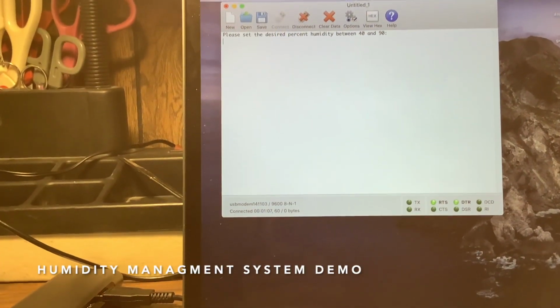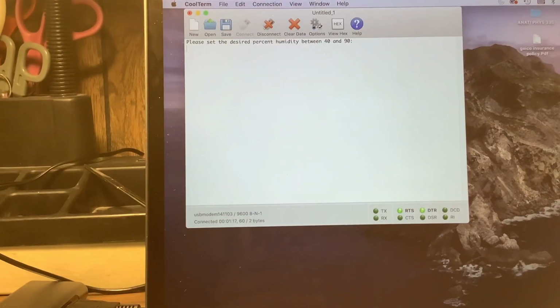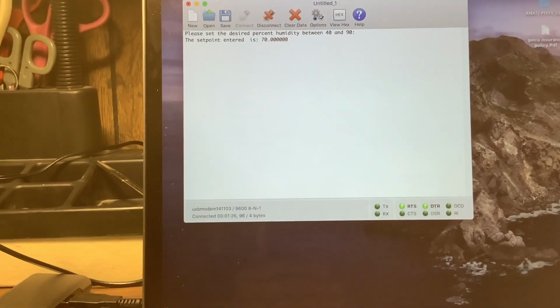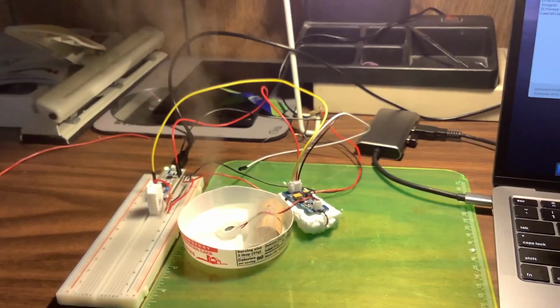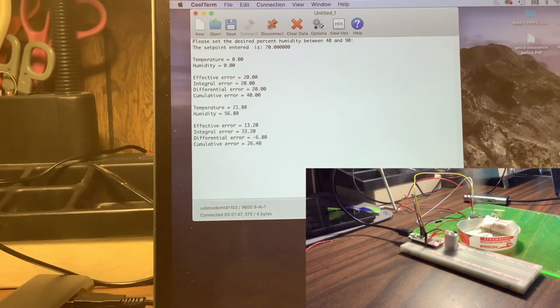So how my system actually works is it first asks the user for a set point that you desire. So I entered 70 here for the demonstration. And so it'll take its first humidity and temperature reading. And the actual logic for the controller to turn off the humidifier, you can see it's on now, is actually based on the error calculation and not just purely whether it's above or below the set point.